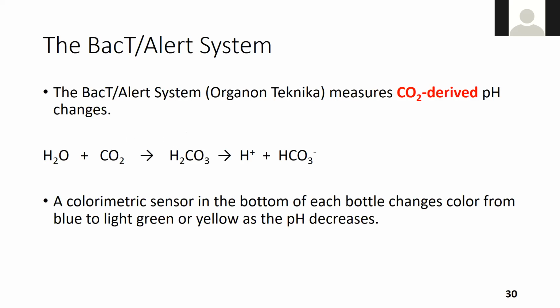A sterile tube can be used instead of the blood culture bottle. We call that the yellow top, not gold, right? Y'all seen a yellow top downstairs? Do we have any? Or we just do blood culture bottles. Y'all haven't even seen a blood culture bottle? No? Good. It's going to be fun.